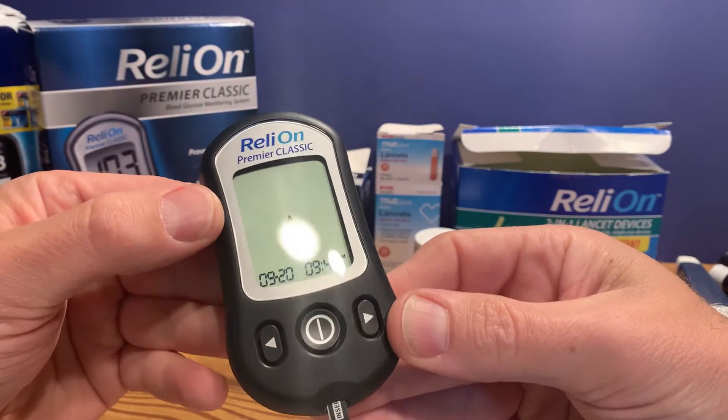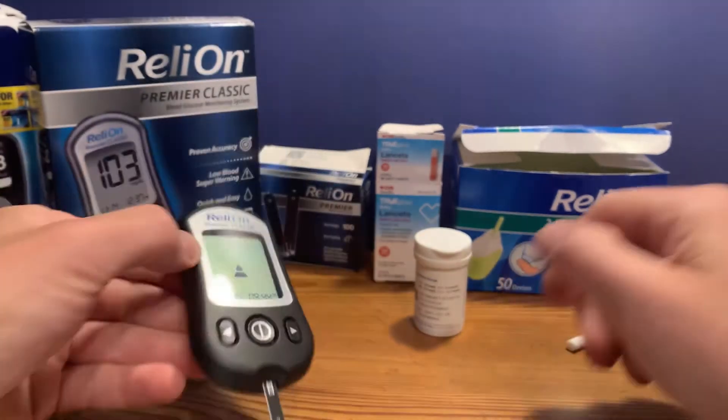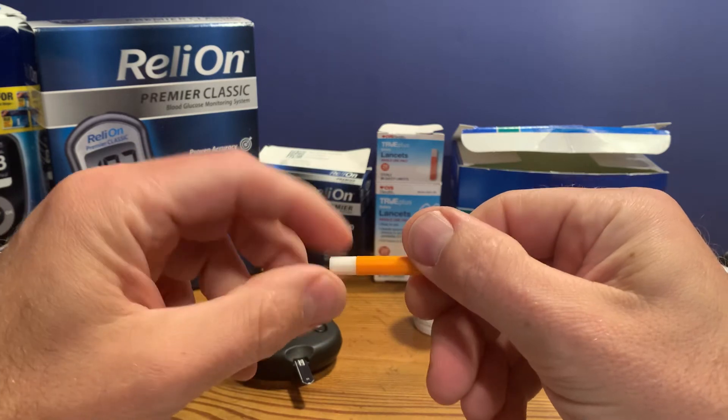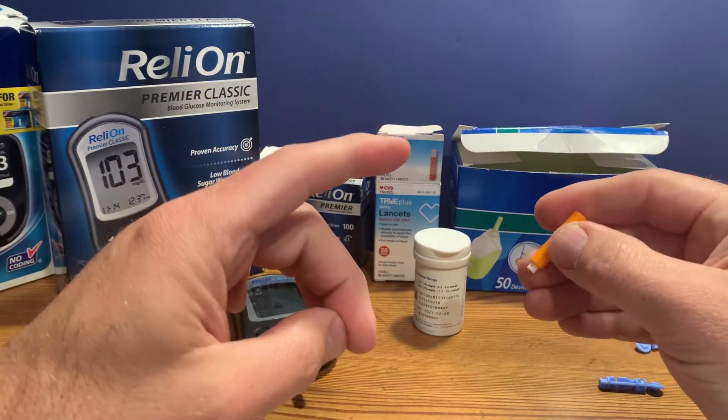It's telling us it's ready for the drop of blood. We're going to use this CVS single-use lancet here. You remove the top and it's ready to go. You want to poke the side of the finger.